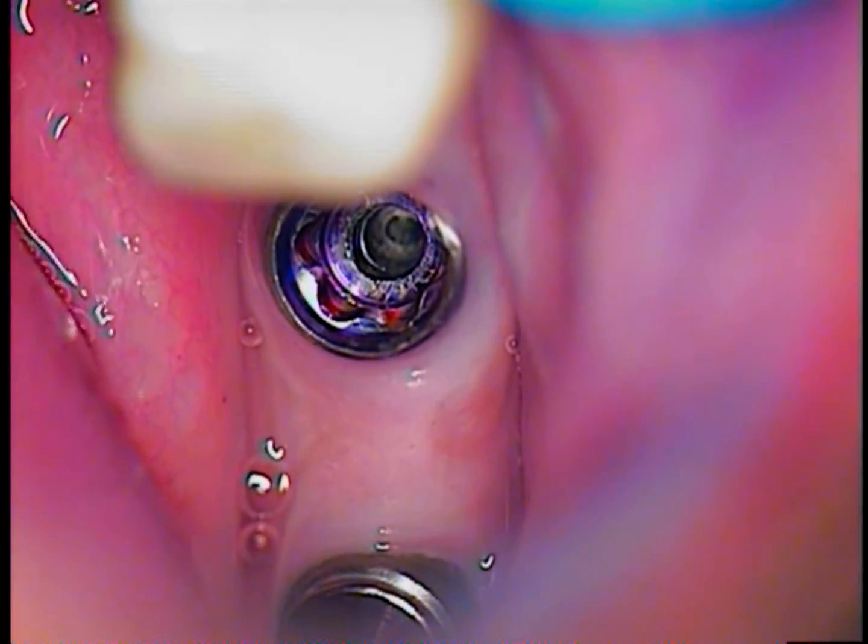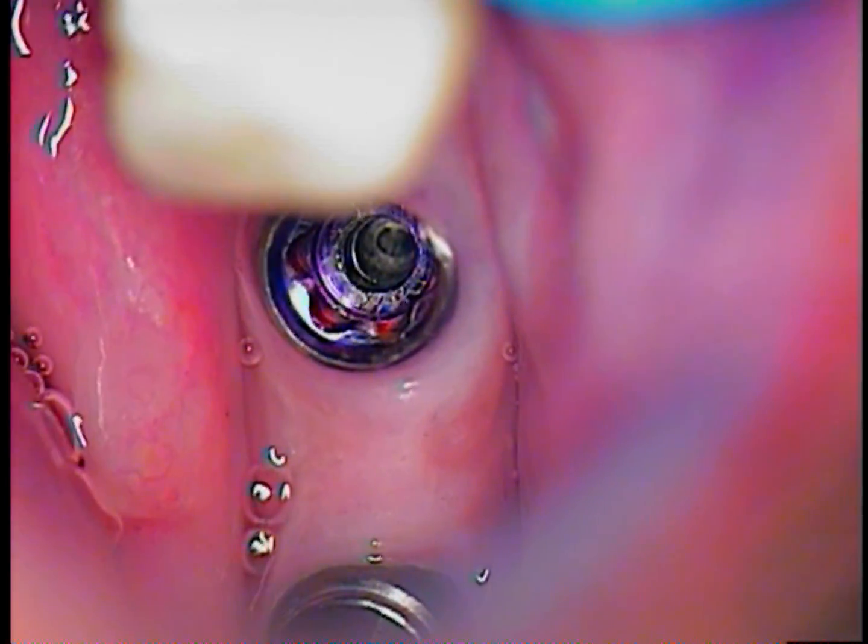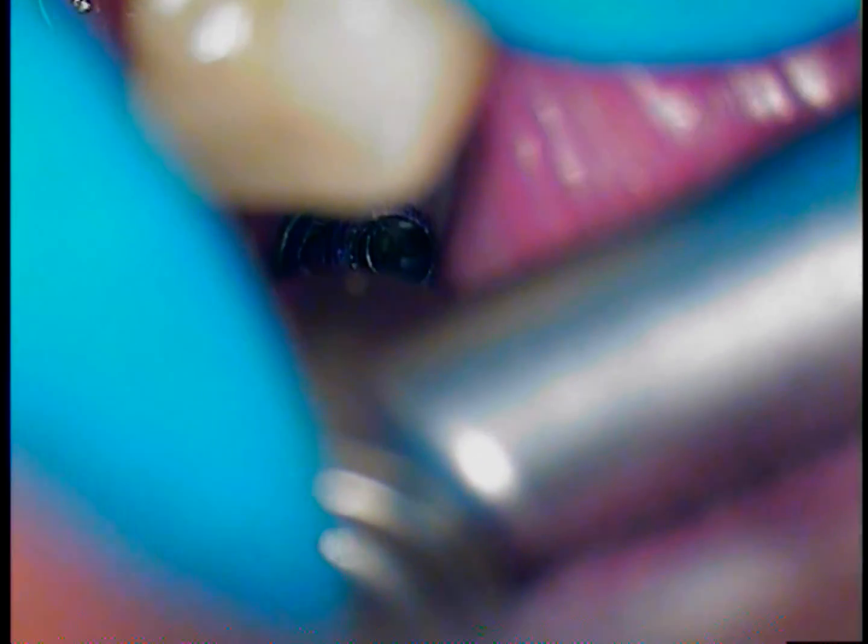Now there's been some suggestion that the flat screwdriver itself needs to be a very strong, almost like a tungsten type of metal. So here we're measuring again the diameter of the slot. The slot was created with a quarter round burr and was slightly enhanced with a 33 and a half inverted cone.